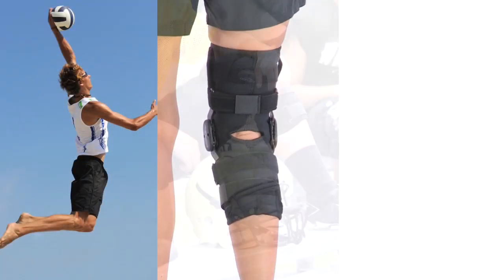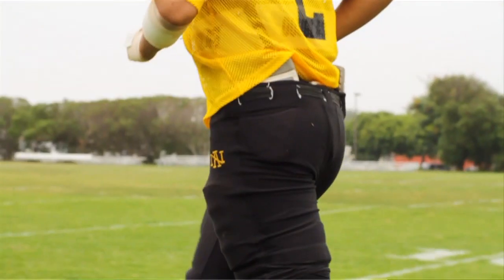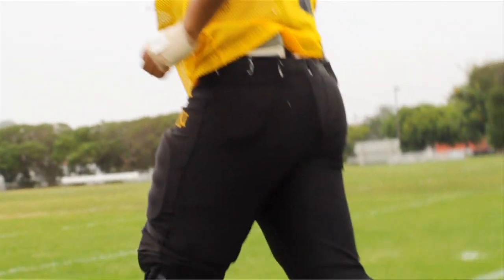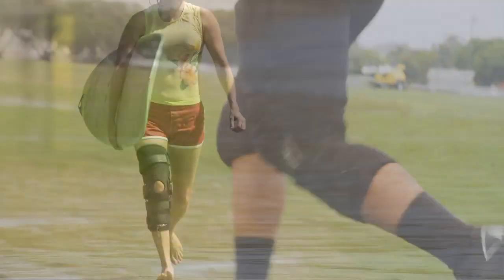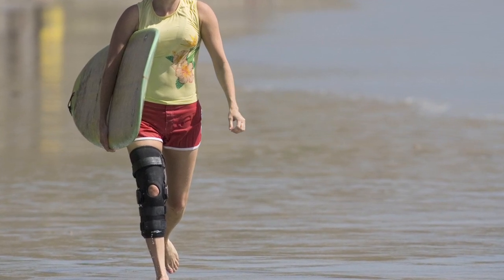Used by volleyball, football, and soccer players, the DonJoy Playmaker is the ideal knee brace for athletes with mild ligament instabilities for both contact and non-contact sports. Get back into action confidently and comfortably with the DonJoy Playmaker knee brace.